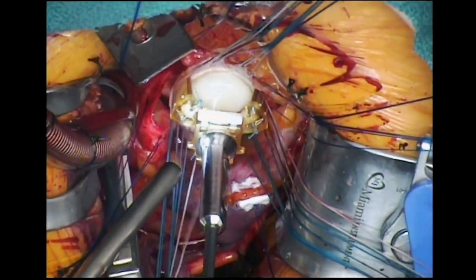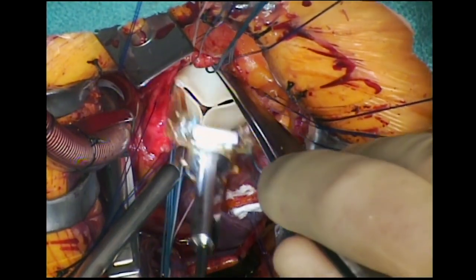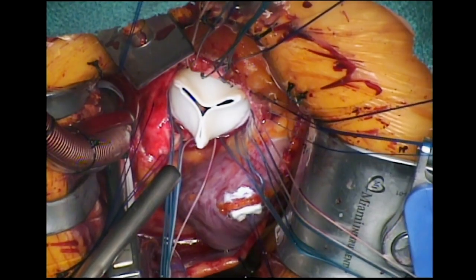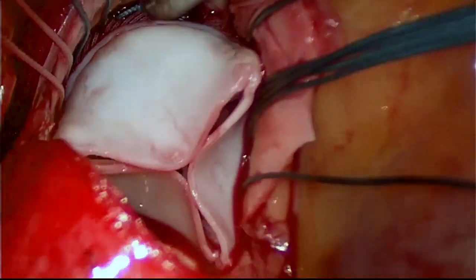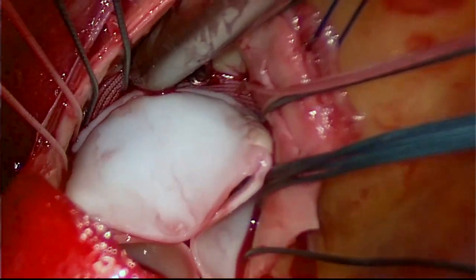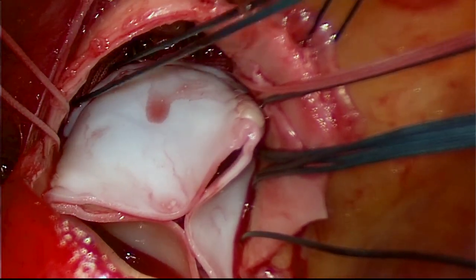In this case, a bioprosthetic valve is delivered down to the annulus. The sutures may be tied by hand using a knot pusher, though our preference is to use a titanium knot fastener.